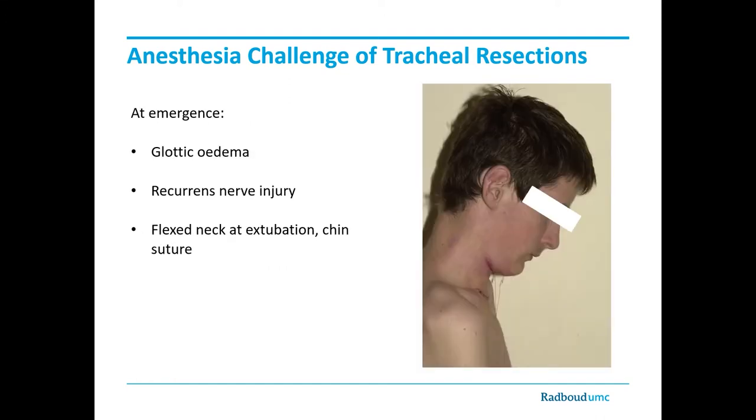At the end of the surgery, patients are ideally extubated. This period is also risky. If the upper part of the trachea and the cricoid is resected, there is a chance of glottic edema with the risk of asphyxia. There is also a possibility that the recurrent laryngeal nerves are injured with vocal cord paralysis as a consequence. If bilateral, the vocal cords remain closed.